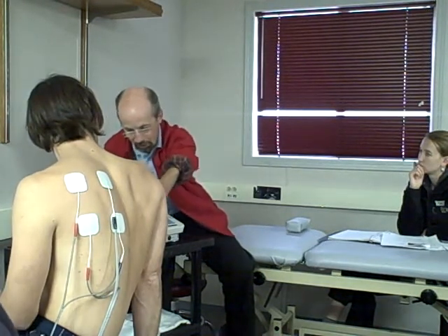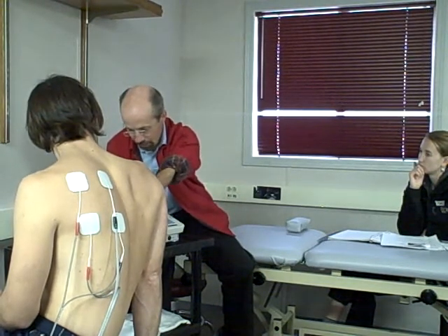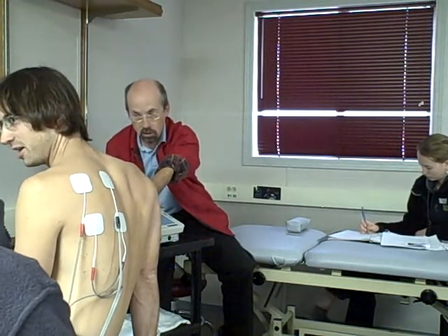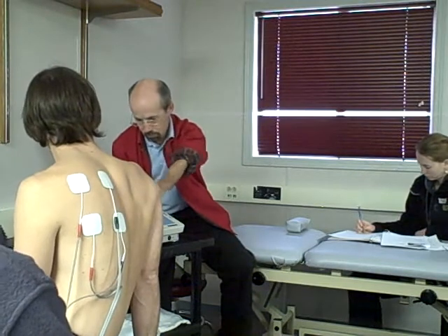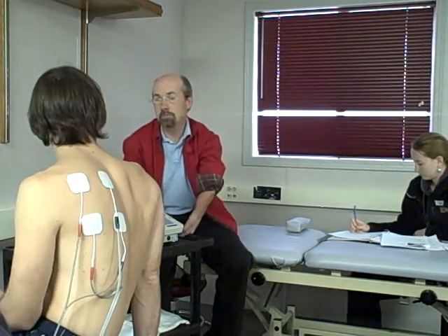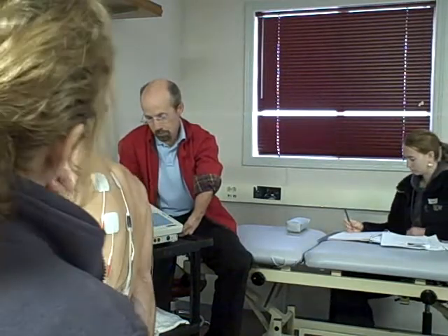So if I go down here, and this is flashing again, I can change it. They'll almost overuse activating it. The patient likes this, and that could be too high. Probably is a little too high. Is this where you're changing the frequency? No, the difference between each intensity is volume. Okay.